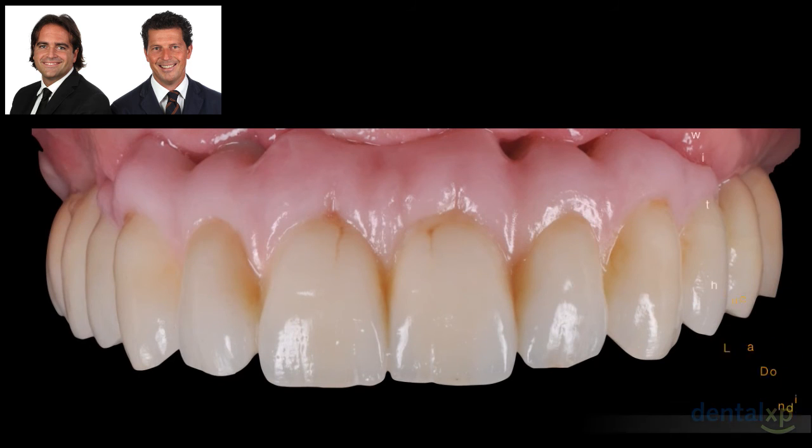And here we screwed in the upper restoration to Sergio, in where we can see all the artistic talent of Luca. We can see that also in these cases the white and the pink aesthetic are blending together.